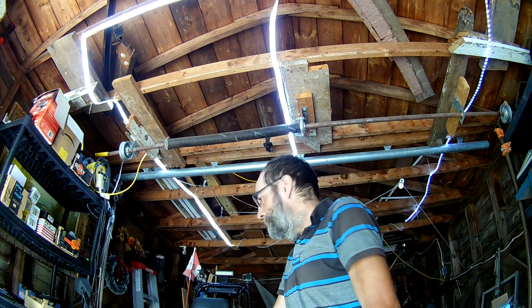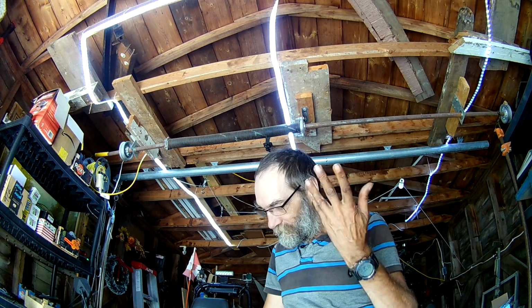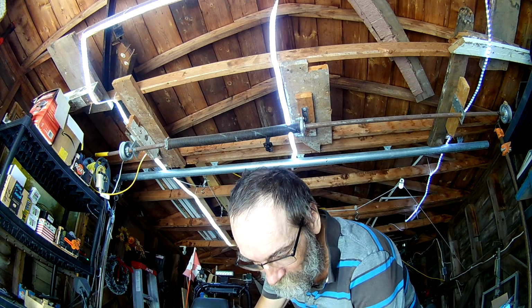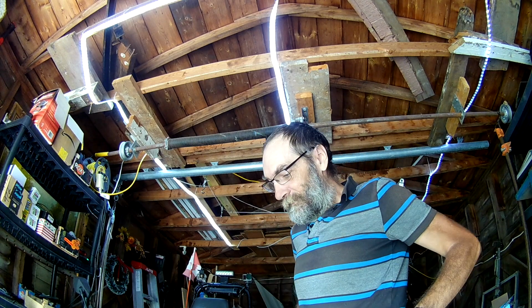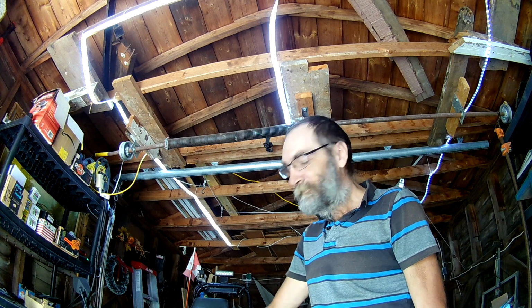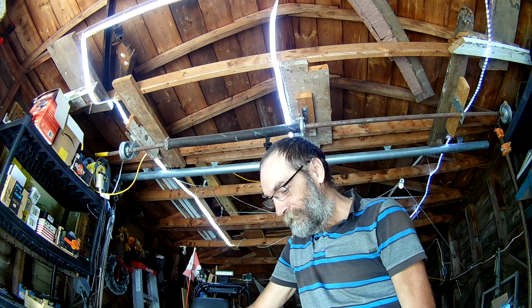So, I have nothing else that I'm planning on doing today. My goal is to get this working. I come up with a solution. One of my update talks, I explain. Actually, I should go through the whole thing now. One of my update talks, I was explaining a new problem with the monster. So I went out for an evening drive, or night actually, and I noticed my headlights weren't as bright as they normally are.